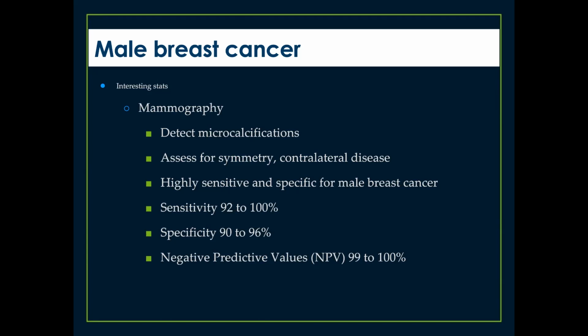The sensitivity and specificity numbers are well over 90%. And there's a very high negative predictive value. So if the mammogram is negative for any suspicious findings, we can feel confident that the patient does not have breast cancer.